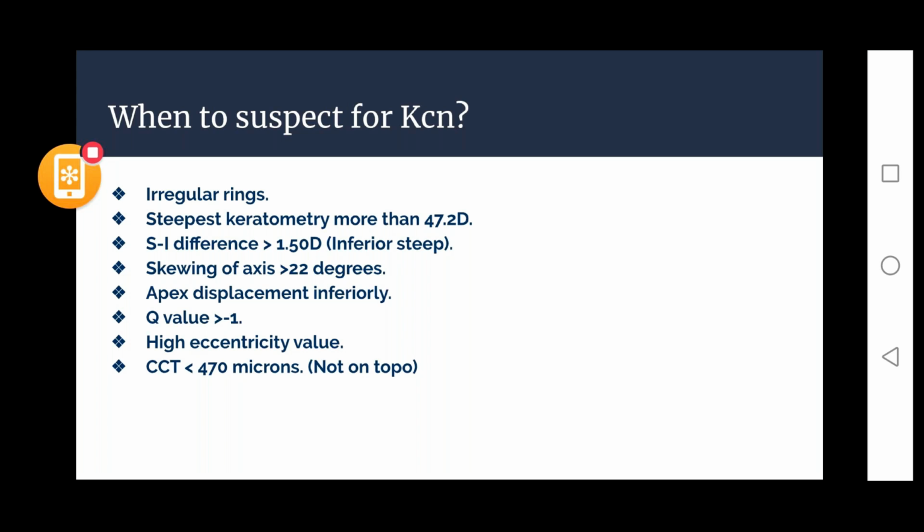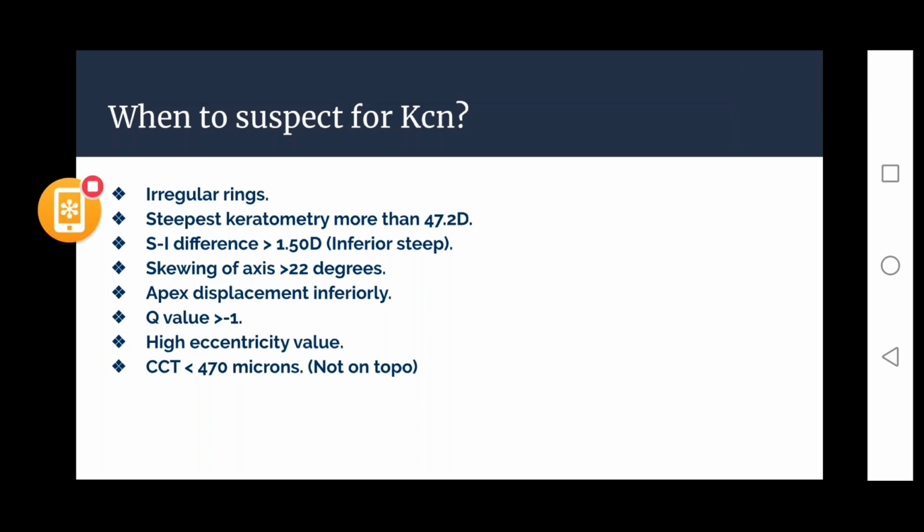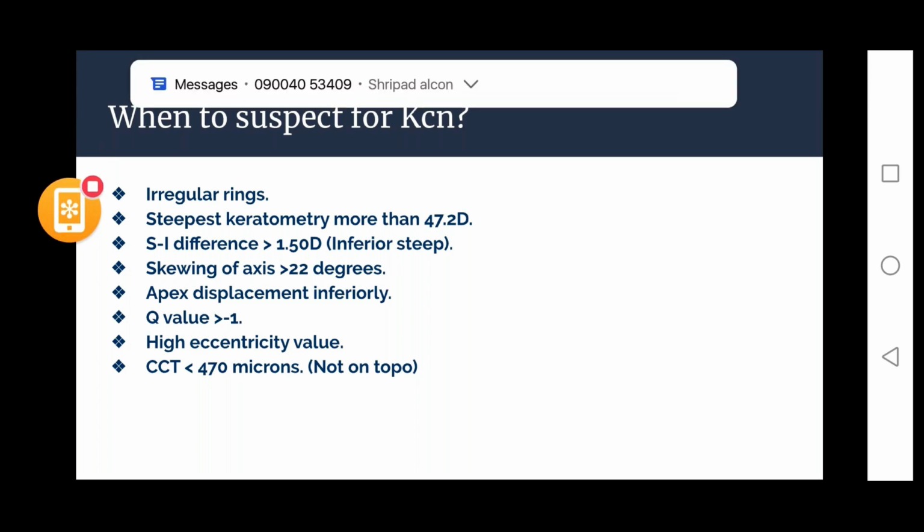So suppose any of you is owning an optical showroom, or you have an optometric clinic, and you don't have access to a topographer, it does not mean that you cannot diagnose a keratoconus. You can definitely diagnose. You have got a very beautiful tool known as a retinoscope. So that's how it is.